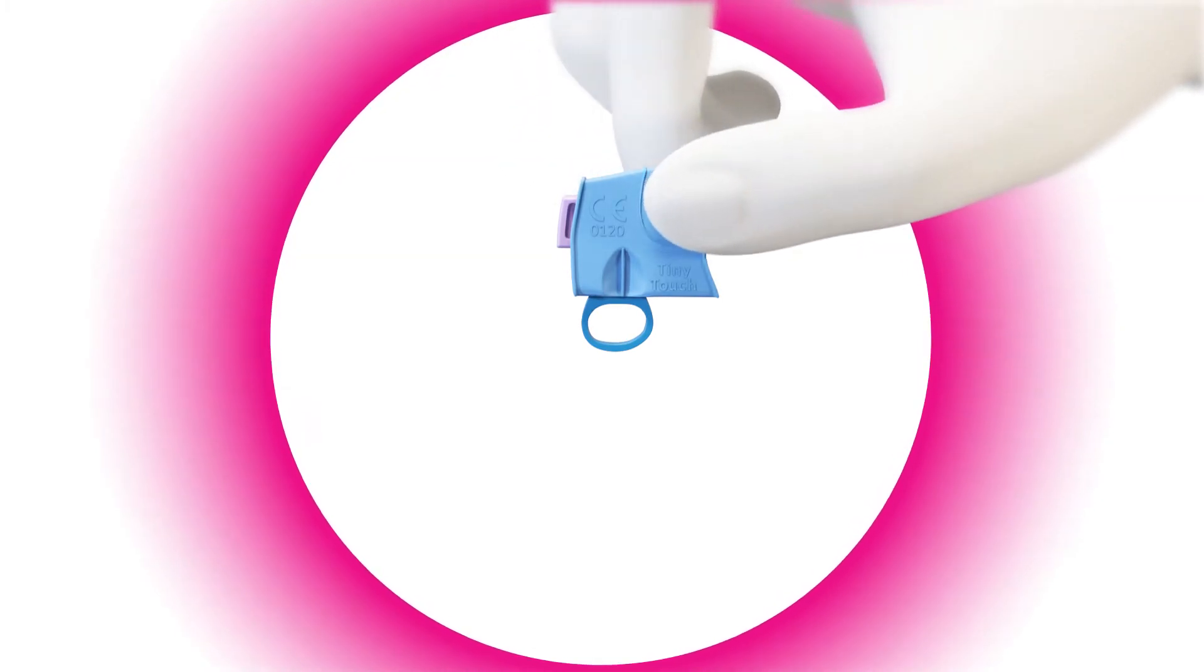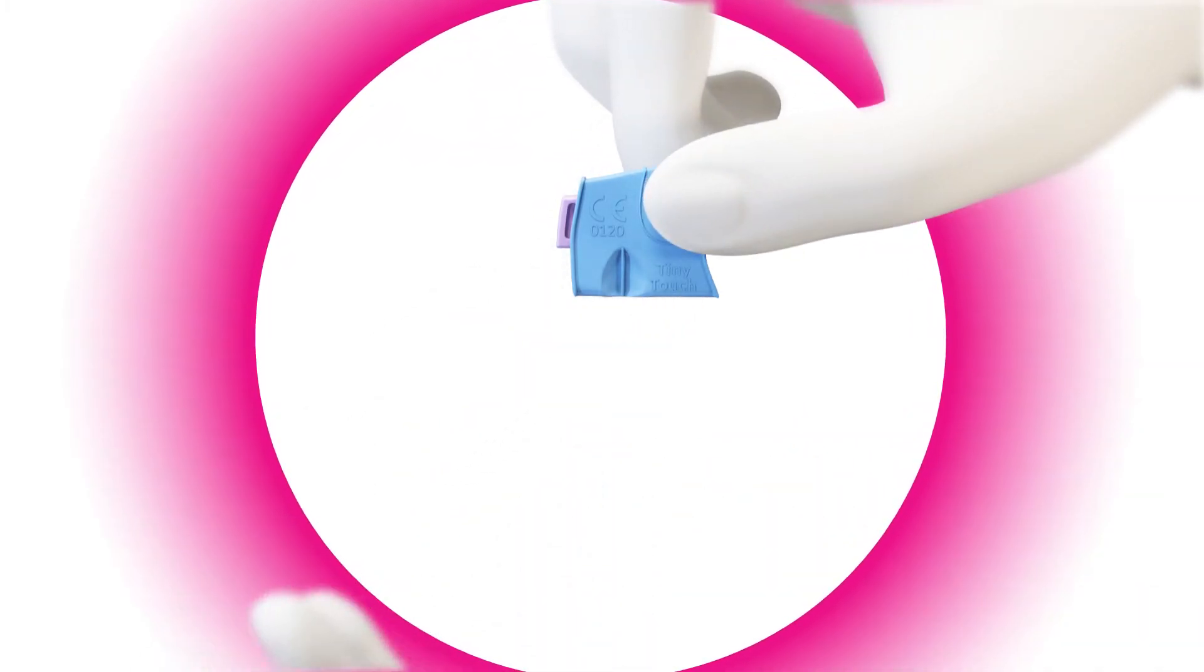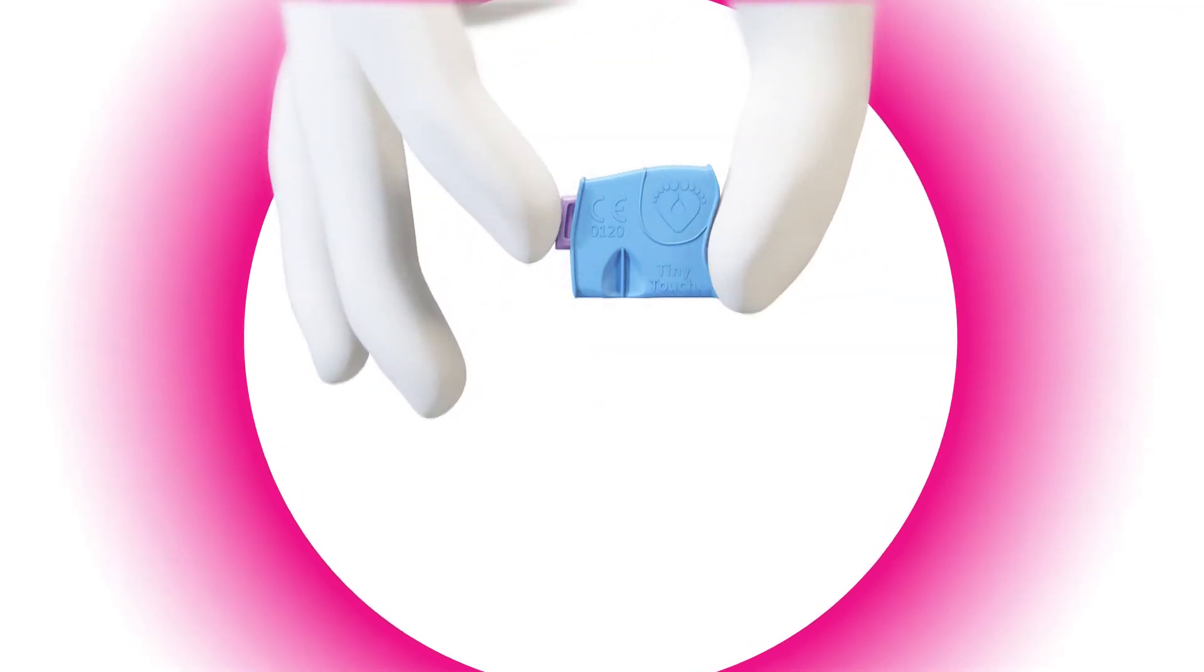Remove the sterility tab by pulling it straight off. Hold the Unistick Tiny Touch with the thumb and finger gripping on the wider side.